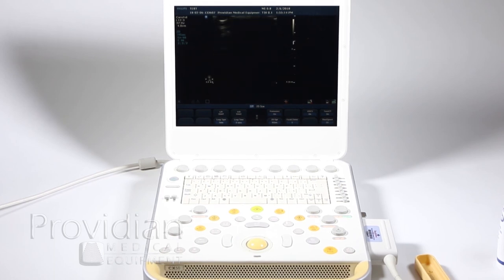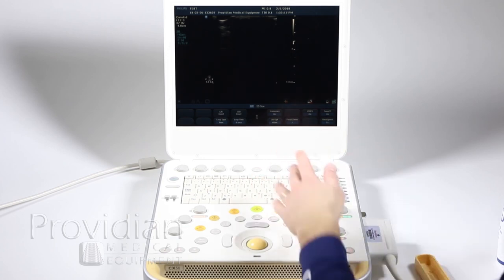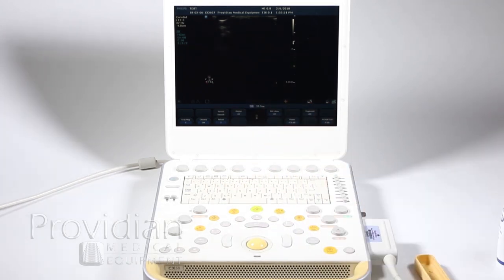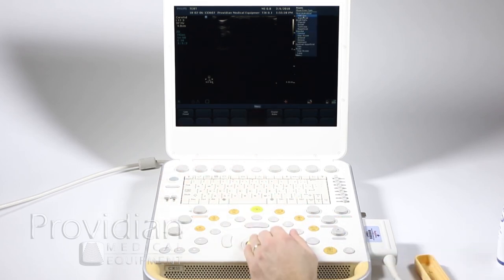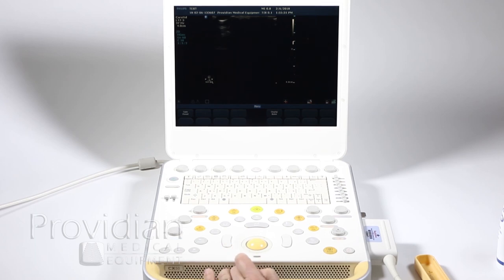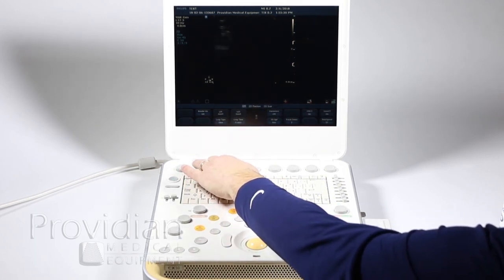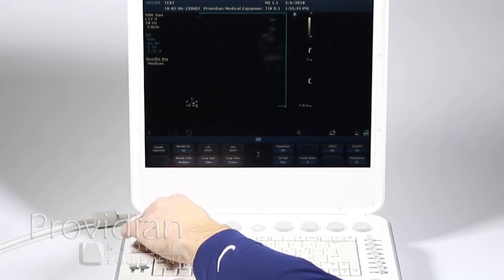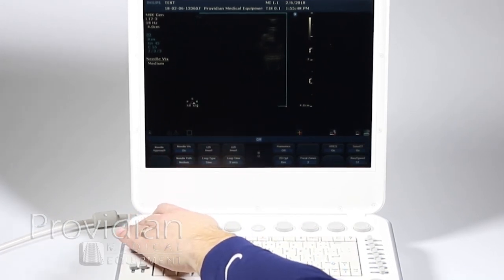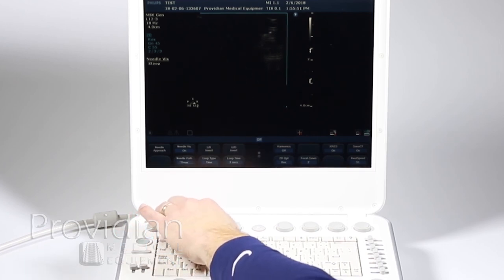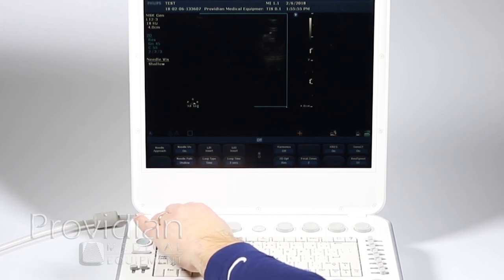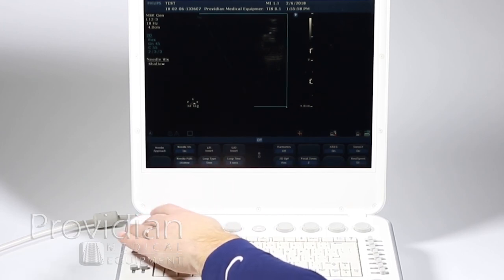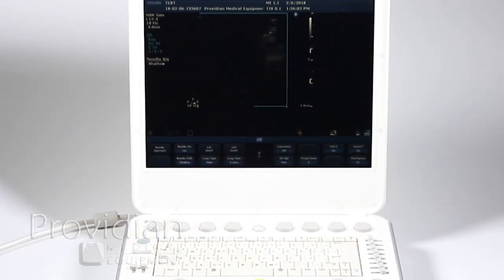While I have this linear probe attached, I'll also show you needle visualization. There's no way to turn this on right now because I'm using the carotid preset — it won't turn it on for certain settings. To use needle visualization, you need to choose a different preset, like MSK General. Click on that, and you'll see needle visualization added. Click that on, and now you have needle approach — you can select which side — your path, and whether it's shallow, steep, or medium. You can simply turn it on and off. The needle wants to go parallel with that line in order to really glow on screen.